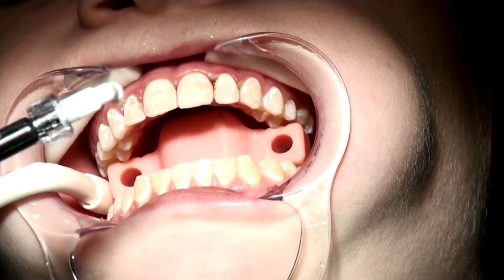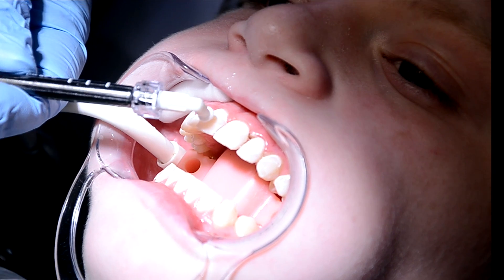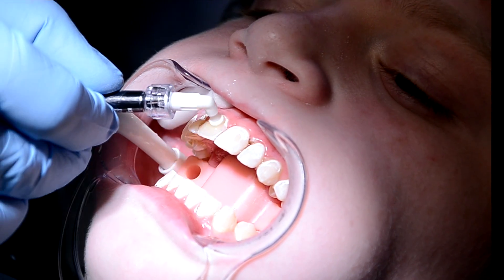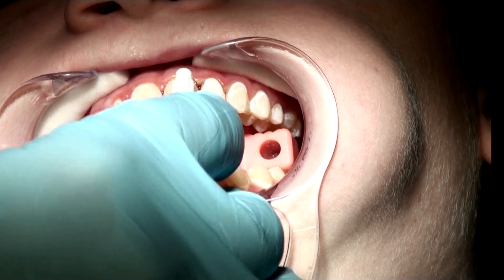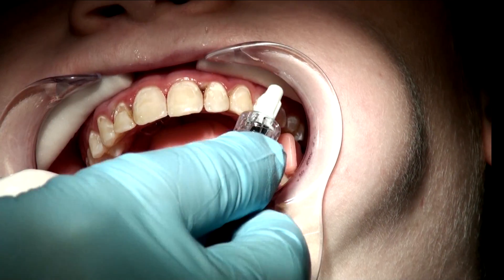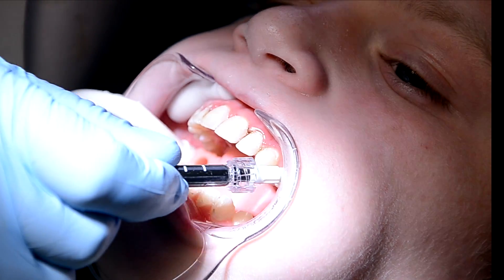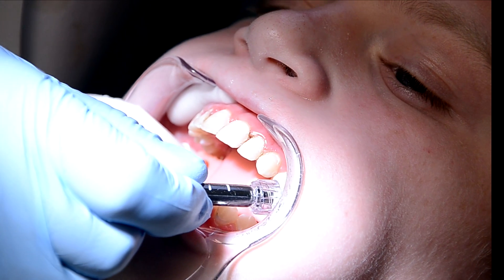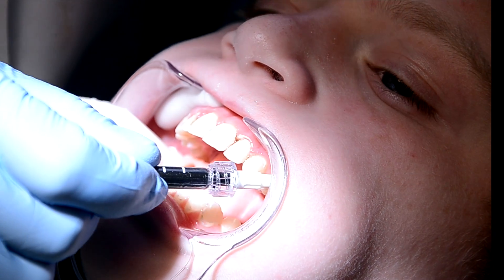Now we're going to apply the Icon. A special applicator brush allows the material to be distributed and rubbed into the area. This stays on for three minutes. The Icon is actually absorbed into the decalcified areas by capillary action, and it infiltrates down into the enamel and into the first third of the dentin, if necessary.